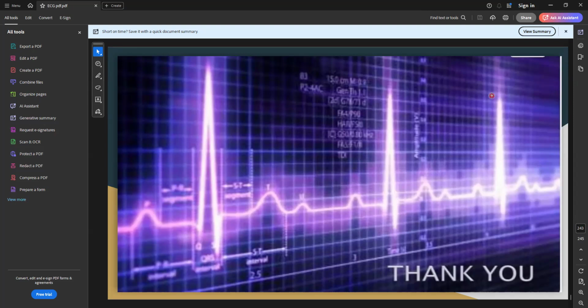Hello, ma'am. Yeah, tell me. Ma'am, what ECG changes can be seen in cor pulmonale? Cor pulmonale, that depends. It will have right ventricular hypertrophy. So you will be seeing the changes of right ventricular hypertrophy along with pulmonary hypertension, because cor pulmonale patients will have pulmonary hypertension. For each disease, I am not showing any changes. It will depend upon the other associated cardiac problems. You will find the ECG changes accordingly. Yes, ma'am. Okay, thank you.